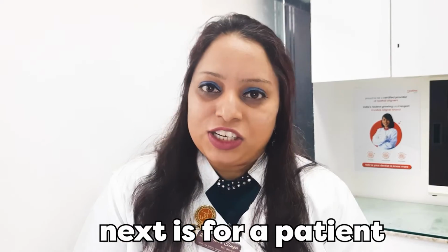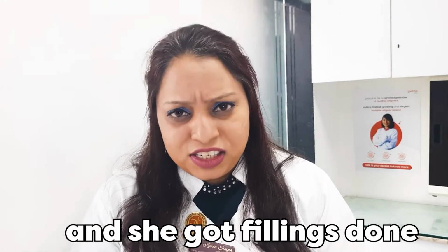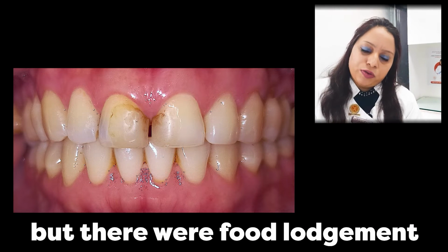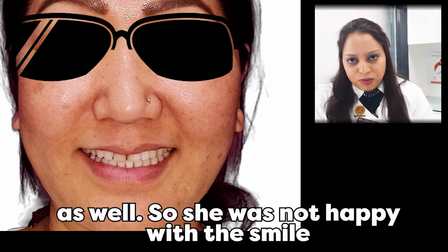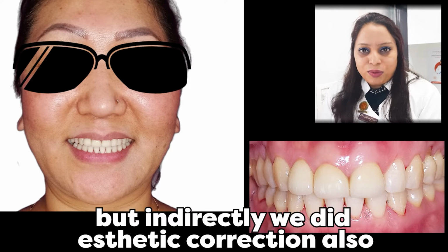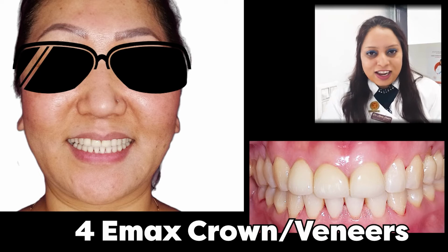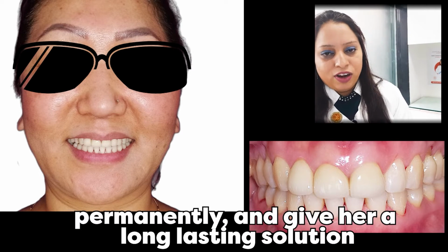Next is a patient who comes from the north and she got fillings done in the front teeth multiple times, but there was food lodgement and there was bleeding in the gums as well. So she was not happy with this smile. Although the requirement was functional, indirectly we did aesthetic correction also for her. 4 Emax crowns/veneers were done for her to improve the smile permanently and to give her a long-lasting solution.